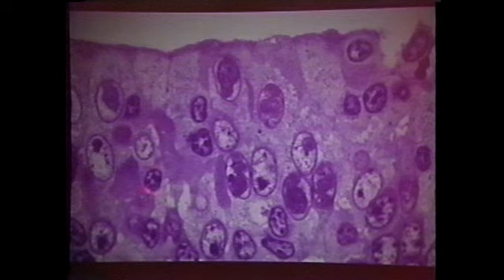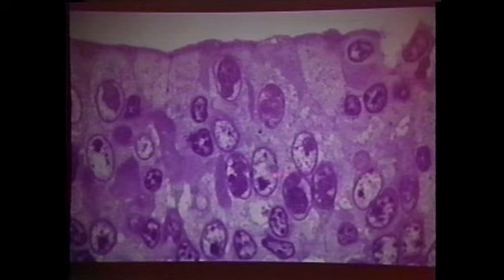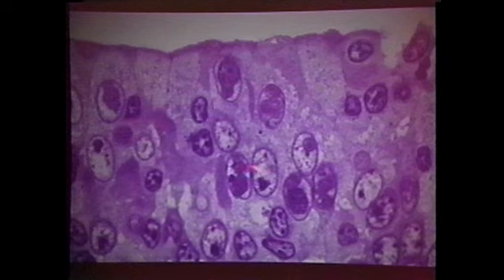And notice, I would suggest that these things are normal epithelial cell nuclei. But notice how they start to get kind of bigger. They don't have as much chromatin. And then they start to have things within it. Okay, what do you think those are? Since I'm talking, I don't think you'll call it bacteria.